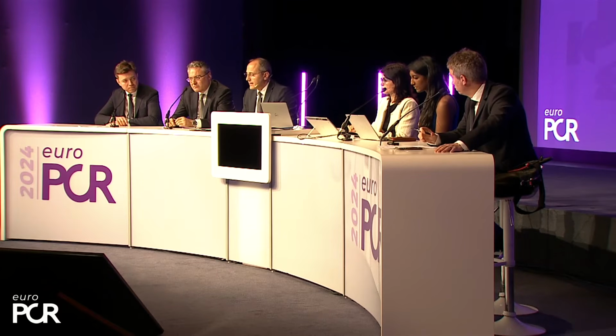And beyond that, I'd like really you to share your techniques with a colleague, how to perform rotablation in this calcified tortuous vessel. It's a circumflex. How to prevent complication. We know that if there is a setting where we might have burr stalling, that's exactly where we can have issue. But with a little bit of technique, this can be prevented. I don't know if Dayan can comment on this.